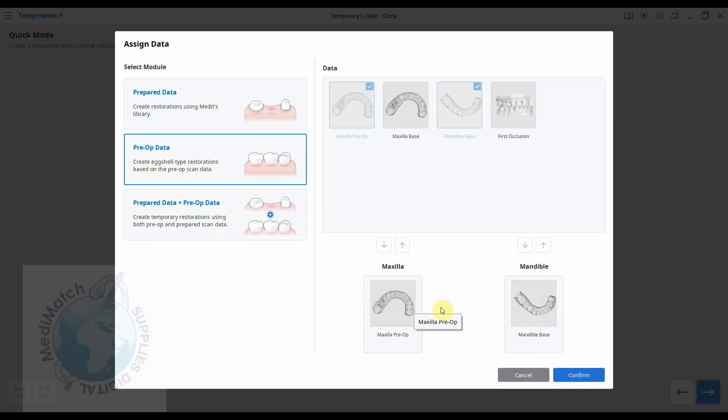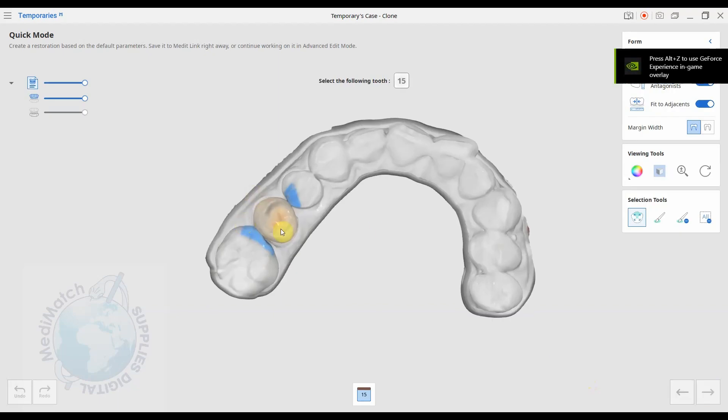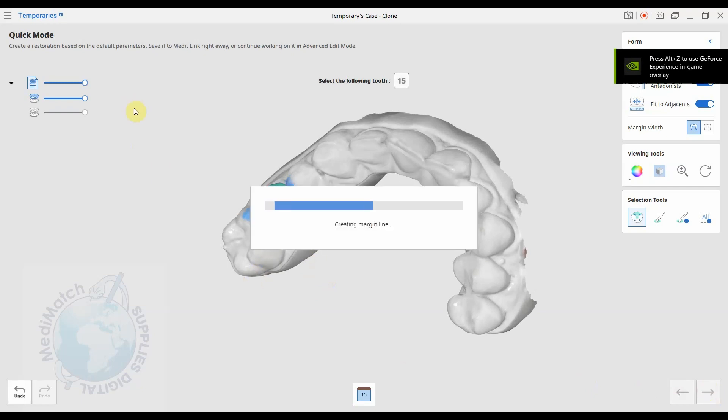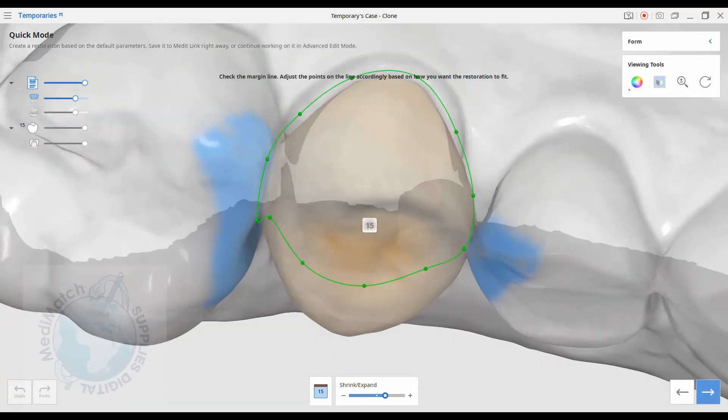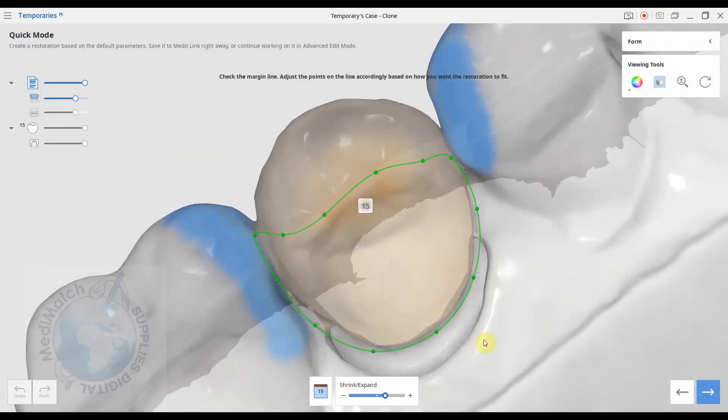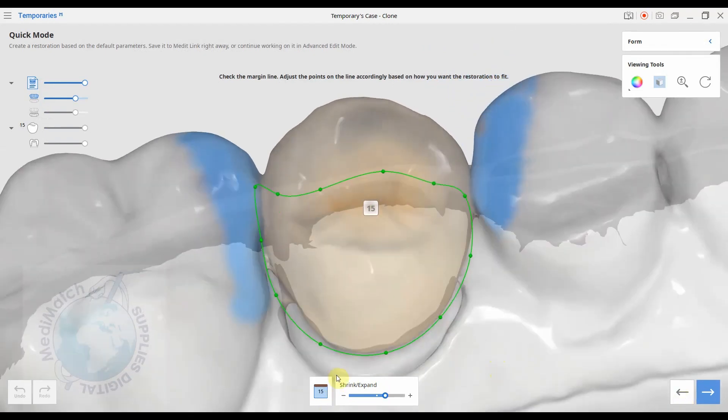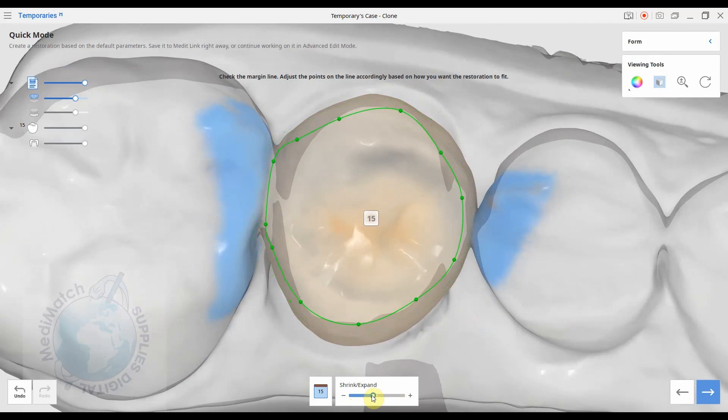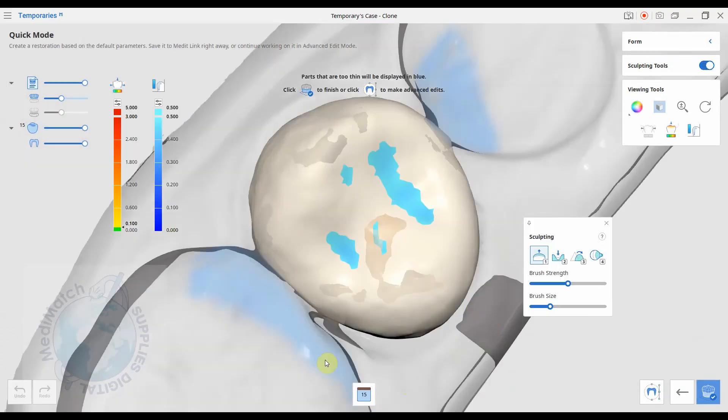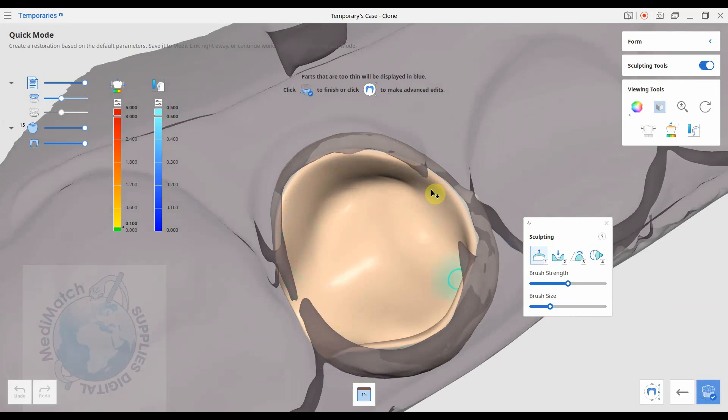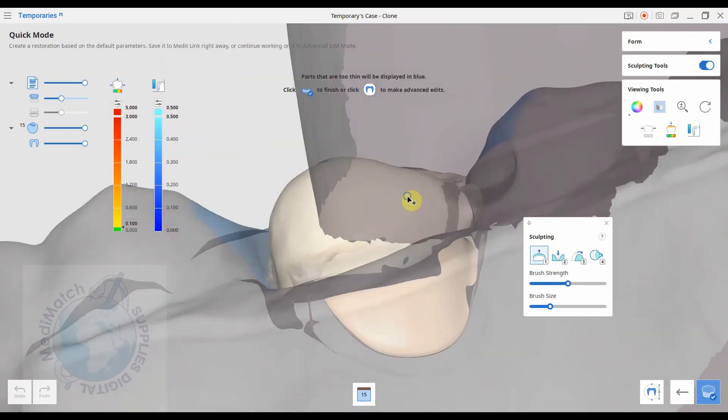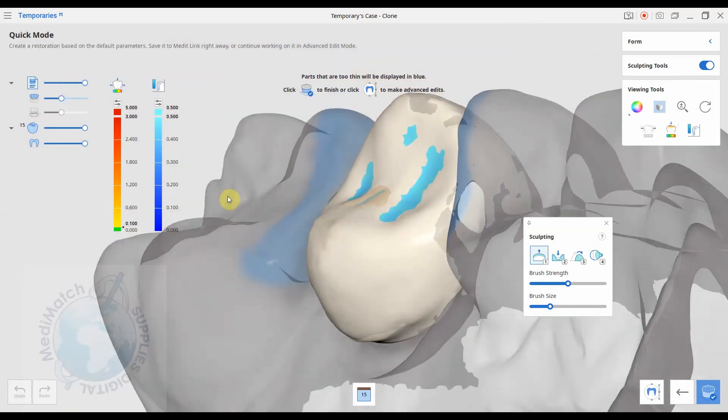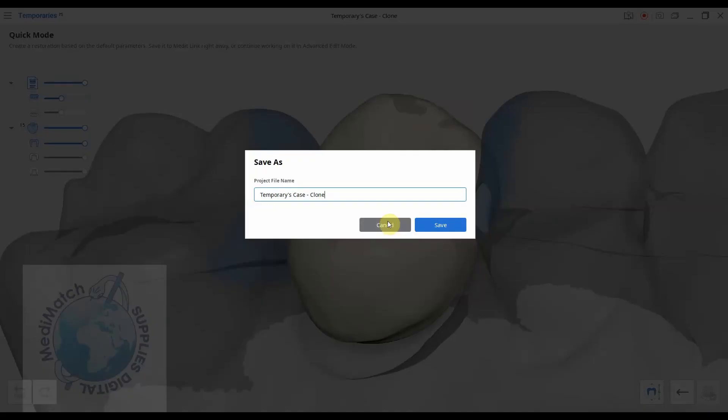We'll try the second option. So this is to create an eggshell type restoration based on the pre-op scan. So all we've got is the pre-op scan and the antagonist. We select the tooth, so we just click on it, it'll highlight, and press next. It's picked out a margin for us that it's going to use for the eggshell crown, but it's going to copy the pre-op data on top. We can expand or shrink the margin. Press next. Okay, so it's created an eggshell crown, so it's not conforming to any prep underneath, it's just an empty space to be filled, but it's copying the pre-op data from the original dentition on top.